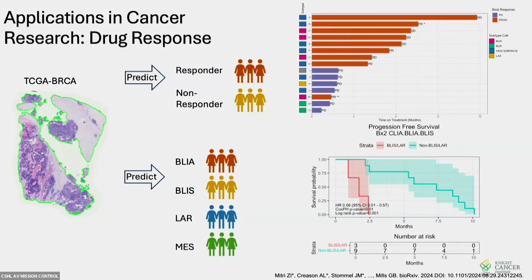And this is a hard task because even though there's a lot of H&E images out in the field, that doesn't always mean that you have the clinical covariates, the drug response, or even sometimes the other data modalities you would want to be able to train these models. We have a set of clinical trials that we work with in triple negative breast cancer where we do have response data. And so what we'd like to do is maybe, if we're not having to do fine tuning of the model, but just taking the frozen weights and building a classification head, see if we have enough data to actually just predict responders and non-responders. The data set's still very small though, so it's unlikely that's going to work.